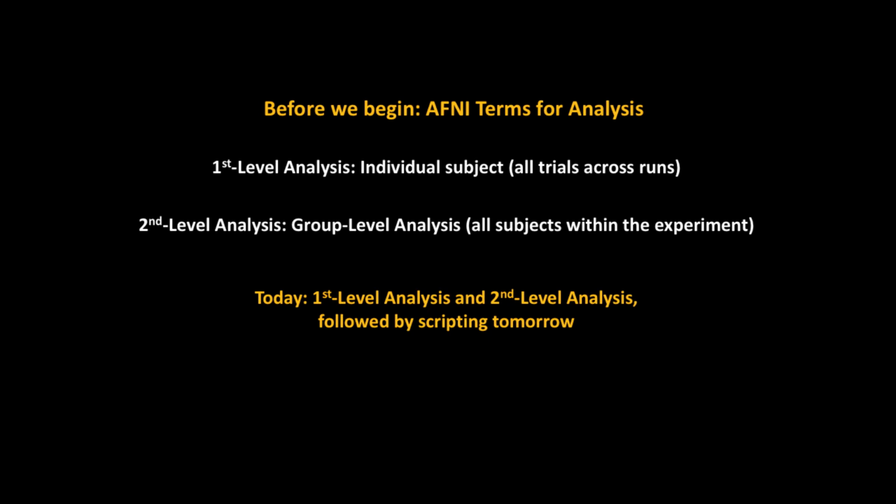It's different in FSL than it is in AFNI. It's just the way it contrasts against that regressor. So if you were doing correct over incorrect, she said that's problematic because FSL treats an empty regressor as a 0. So the beta weight is set to 0, which is what it does in AFNI as well, according to the help page. But I was just wondering if you had any other information. I don't know. That's a good question because it definitely happens if you're trying to model out incorrect or error responses, but I'm not sure.